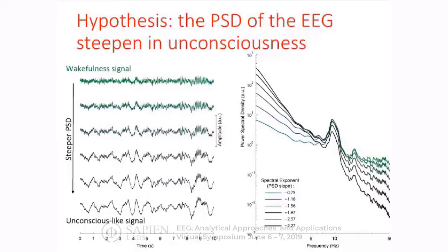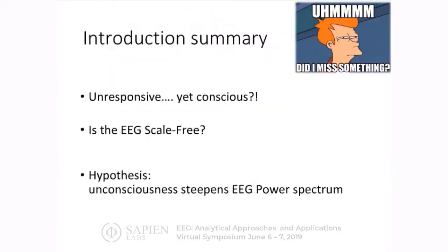So here's our hypothesis: that the PSD of the EEG becomes steeper during unconsciousness.